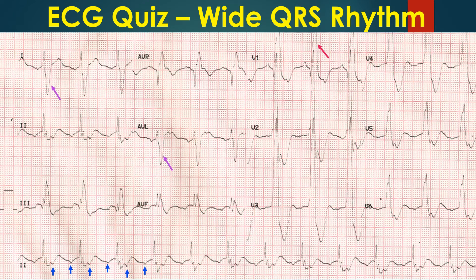2:1 conduction excludes the possibility of an AV node-mediated tachycardia, which would get terminated with the onset of AV conduction block. The QRS is very wide at 200 ms, with a tall slurred R-prime wave in V1 and a slurred S-wave in leads 1 and AVL, indicating complete right bundle branch block. QRS has right axis deviation suggestive of left posterior hemiblock in addition. Fragmented QRS is visible in inferior leads as multiple notches in the QRS complex.